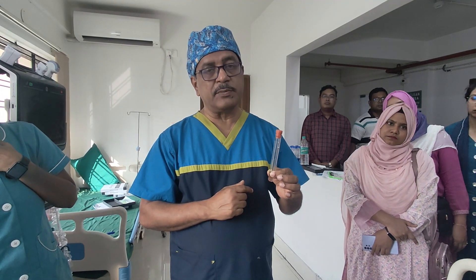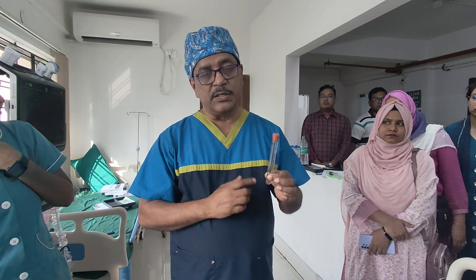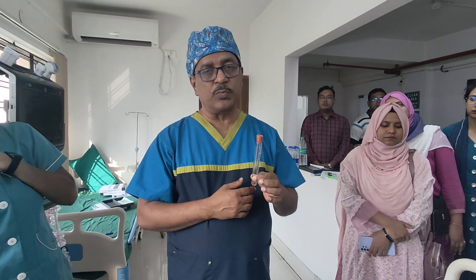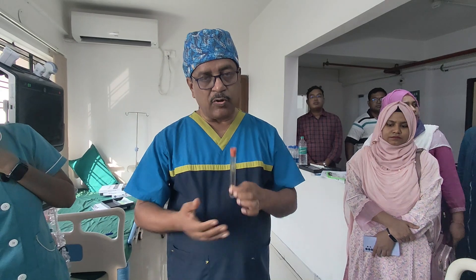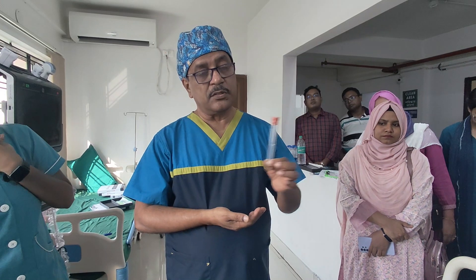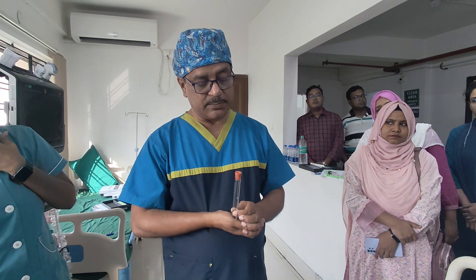Here we are not separating the leukocytes. Research studies tell us that leukocyte-rich and leukocyte-poor plasma don't have much difference, particularly when going for osteoarthritis knee treatment. Our patient here has osteoarthritis knee, and we are preparing this leukocyte-rich plasma.